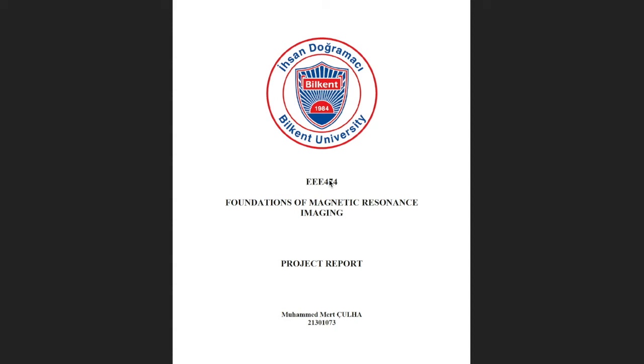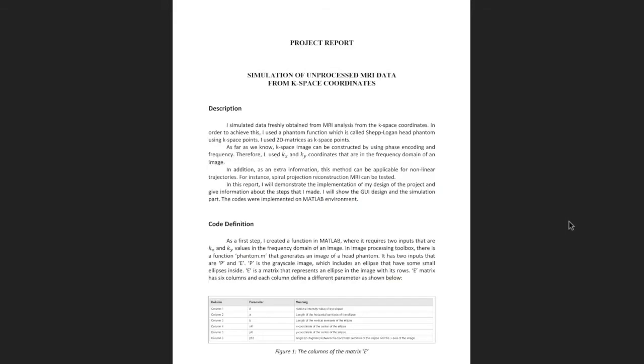Everyone, it's Muhammed Mert Çulha, and this is my project for EEE474. My project is about simulation of unprocessed MRI data from k-space coordinates. I simulated data obtained from MRI analysis from the k-space points.